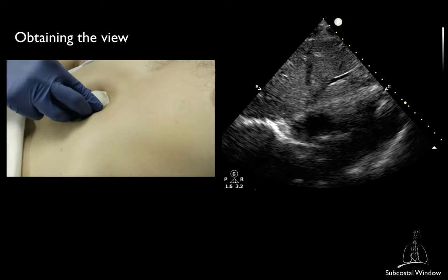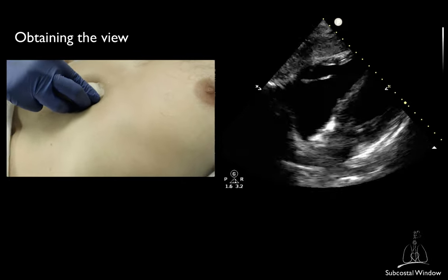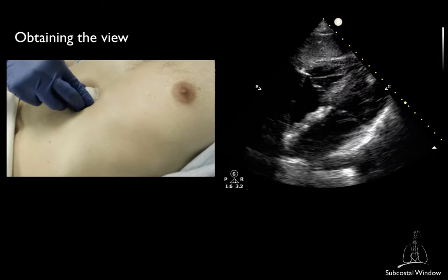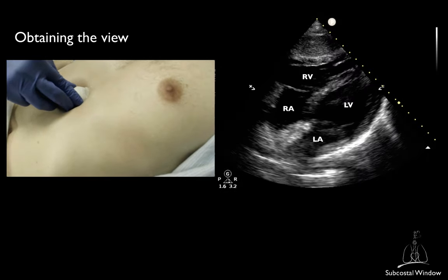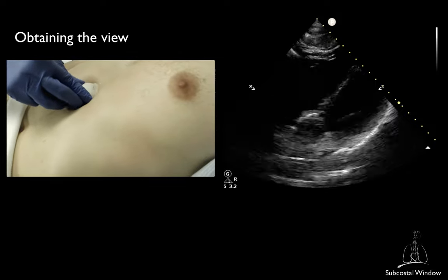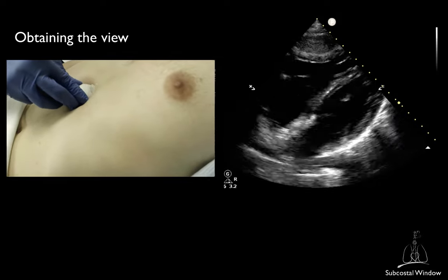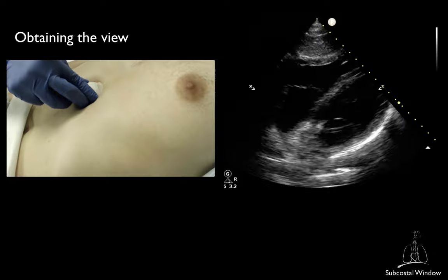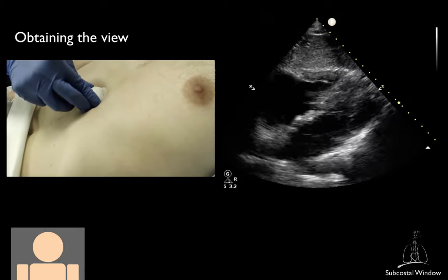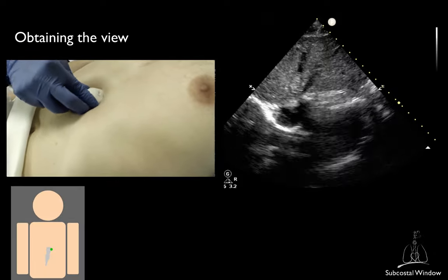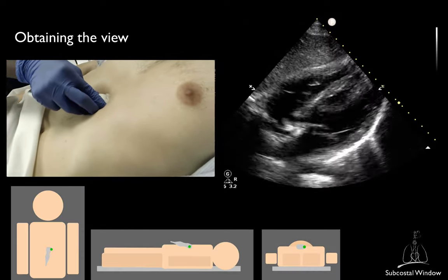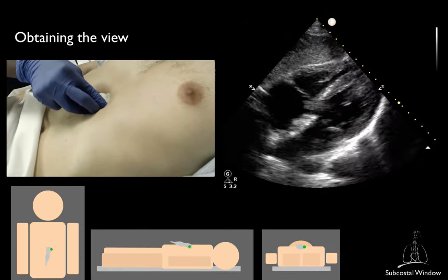Start from the subxiphoid process, from the right side of the abdomen, to use the liver as an acoustic window. If the patient can cooperate, you may ask the patient to bend their knees. For the subcostal 4-chamber view, the marker should be oriented towards the patient's left at roughly 2 o'clock. The probe itself should be almost flat on the patient, and try to get the footprint closer to the subxiphoid process.